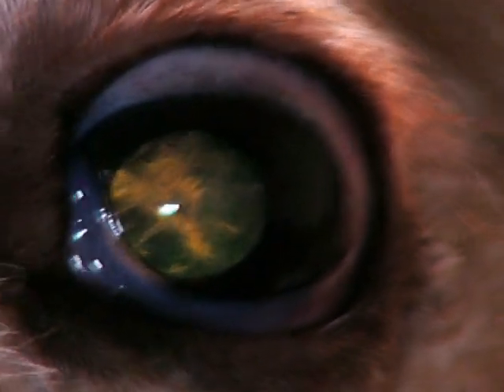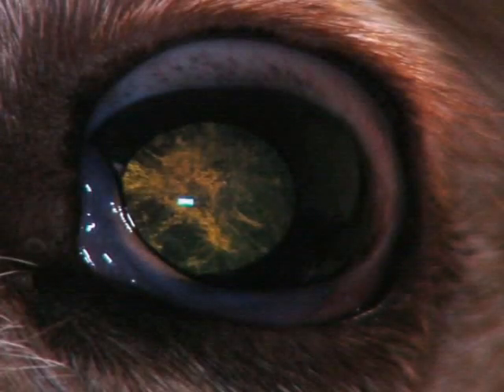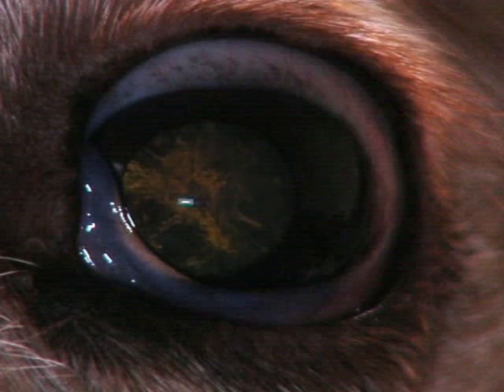When a cataract is identified, the distant direct technique is also useful for assessing its stage of development. If the cataract is quite extensive, then the tapetal reflection will become duller and duller until such time as the cataract is total, in which case you'll get no tapetal reflection, you'll just have a black pupil. And obviously the vision impairment should match the degree of cataract.